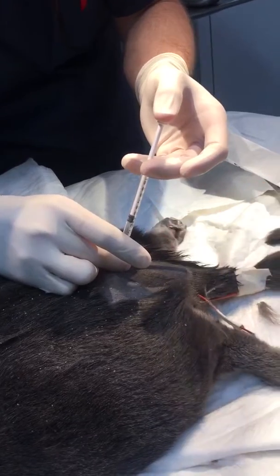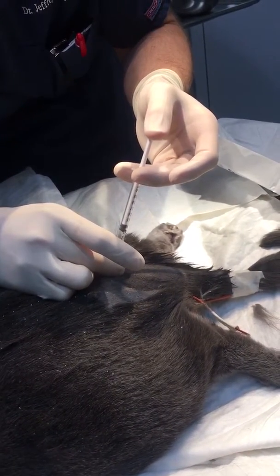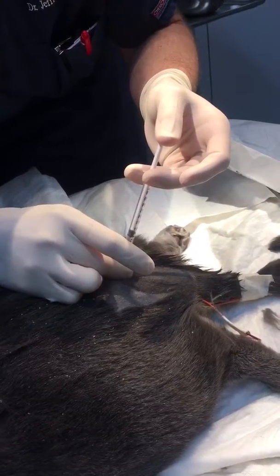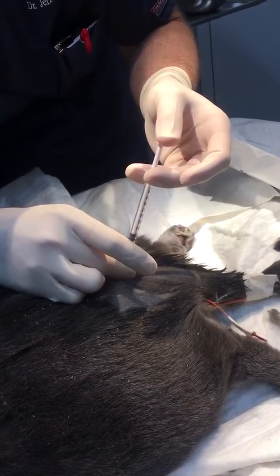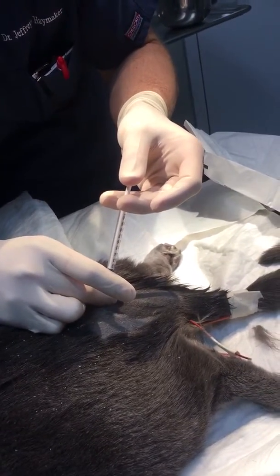If that plunger comes up at all, bounces up, then you're not in. But if it doesn't bounce up, it's the only place it can be. Because if it was in a muscle, it would be hard to inject — there's no place to go. It should be going nice, there's no resistance — zero. No, it's pretty easy.